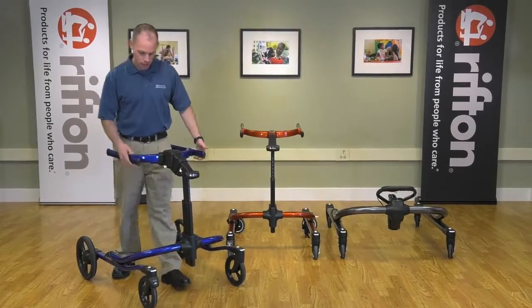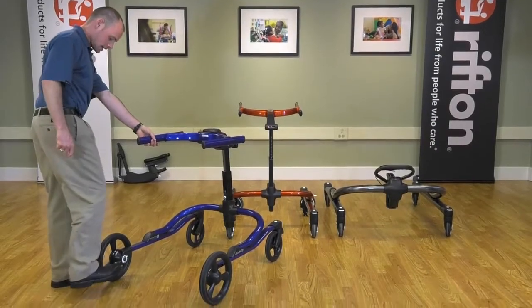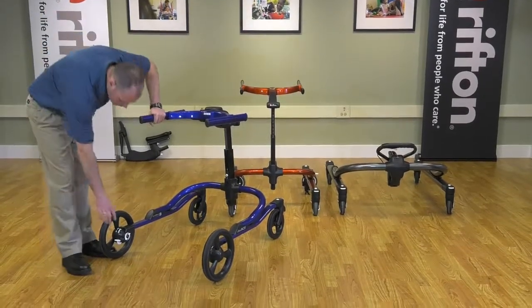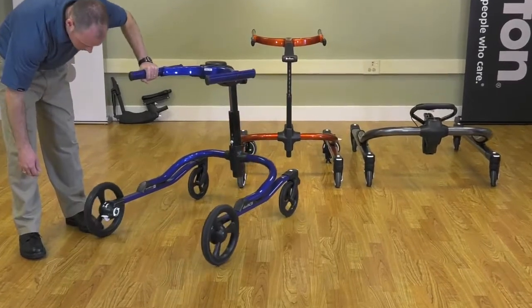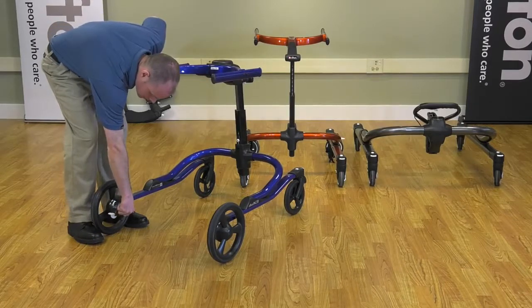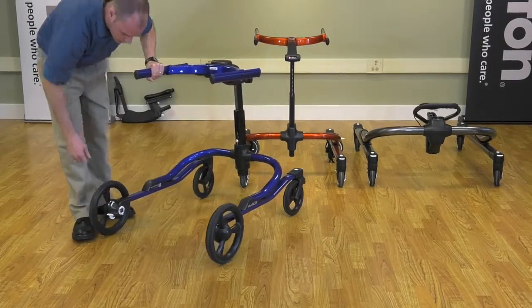So that should be helpful to you. And then the rest of the caster features are at the back here. You've got your brake. You just push it down with your foot and back up with your foot. You've got your anti-reverse lock so that your pacer only goes forward. And then you've also got your drag feature to give yourself a little more resistance, again, very nicely and clearly marked. So that's your drag feature.